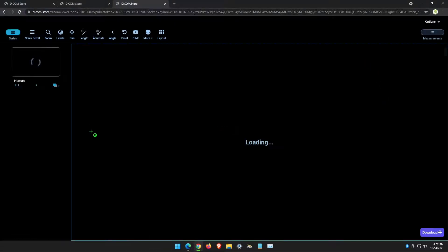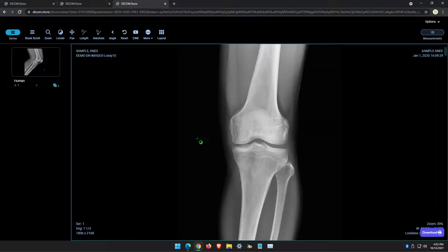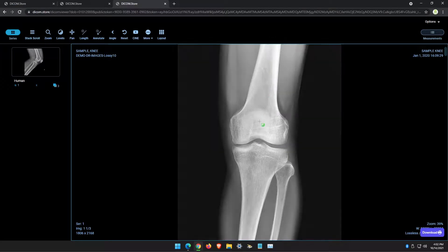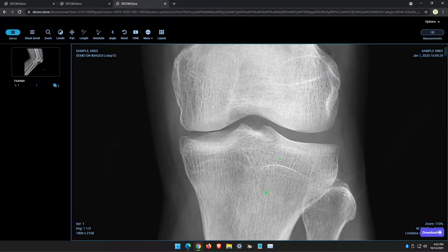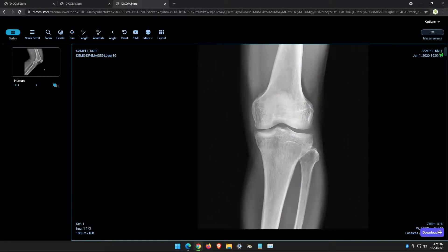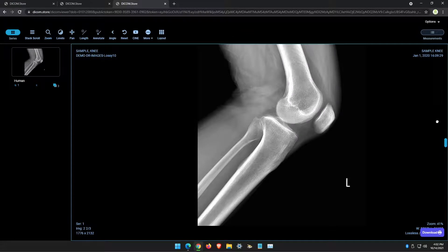This is what the patient will be able to see and how they can view their images. This is a full DICOM viewer where you can window level the image, you can zoom in and out, and I'm just left-clicking and right-clicking on the image to adjust the brightness and contrast and zoom. There's a scroll bar here where you can flip between the images, or you can use the middle mouse button.